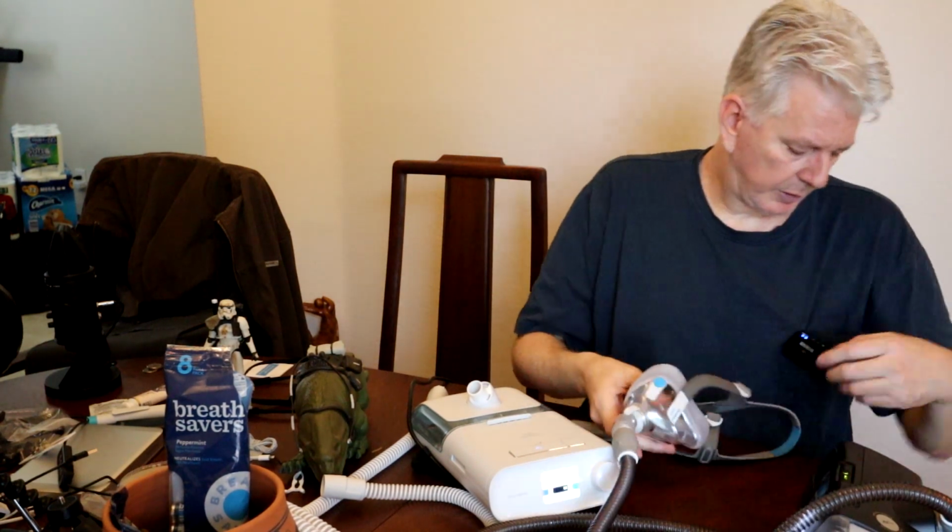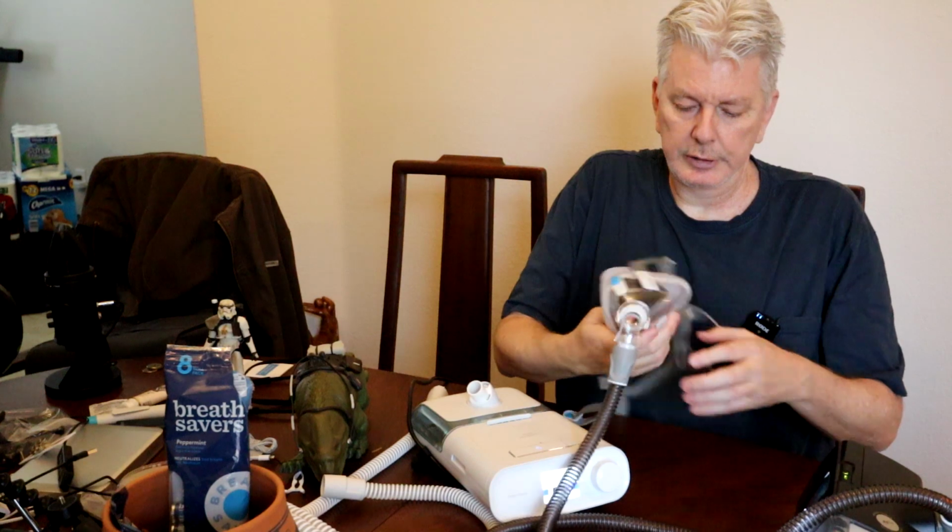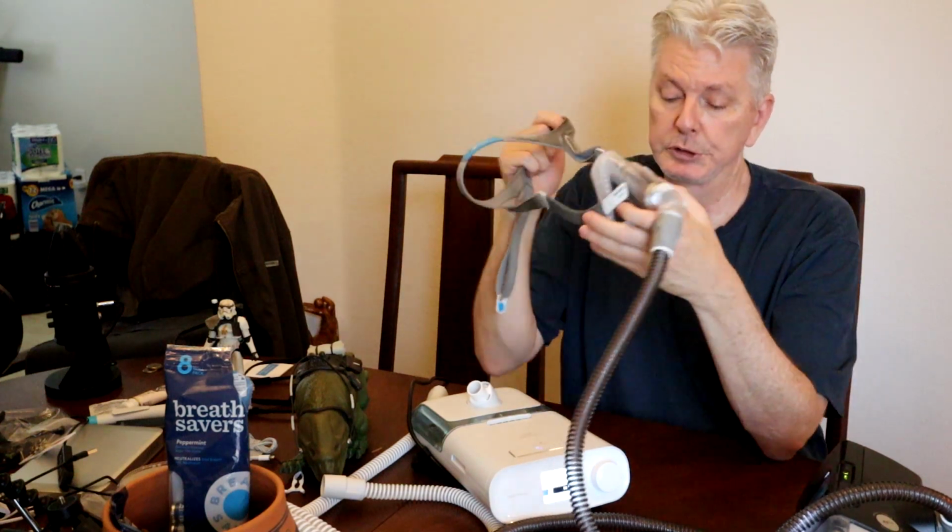Probably the last thing I want to talk about is the sound and the noise level. Neither of these machines are noisy at all. A common misconception with CPAP machines is that they are loud, and they are not. They used to be, I think, 30, 40 years ago when they really first started coming out on a mass-produced level. I have a lav mic here. I'm going to try and demonstrate how quiet these machines are.